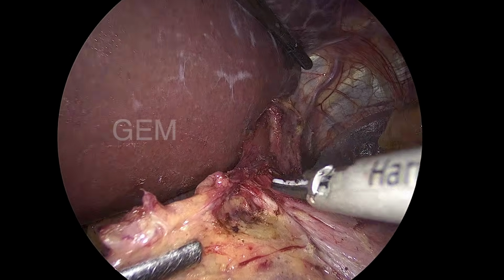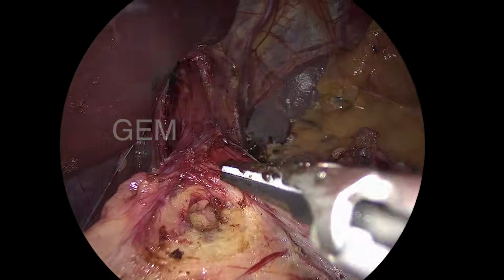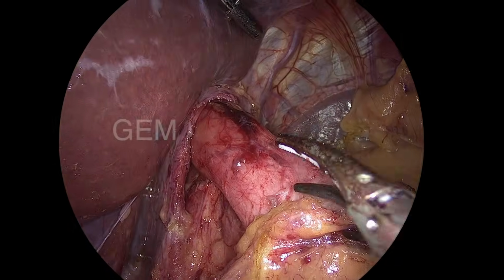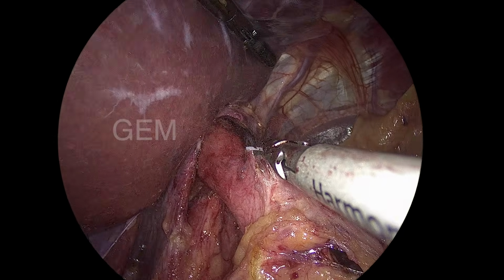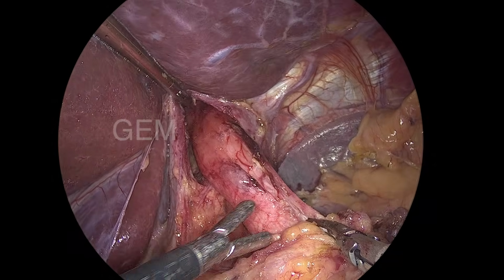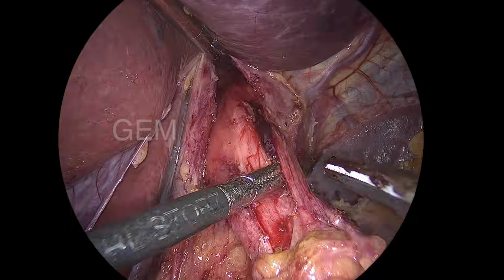Without this type of vagal mobilization, don't do myotomy, that will be incomplete. You should not go deep also. That's why I'm saying both sides, right side and left side. And the aim is to take out this peritoneal covering area, so that the muscle will get bared. So myotomy will be easier. Up to what level you want to have myotomy, you can divide this layer. So that is the vagus nerve.